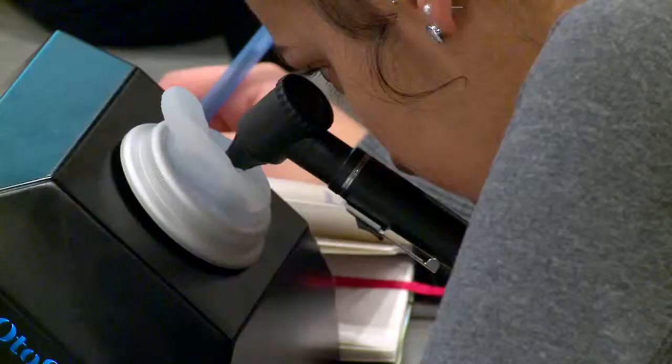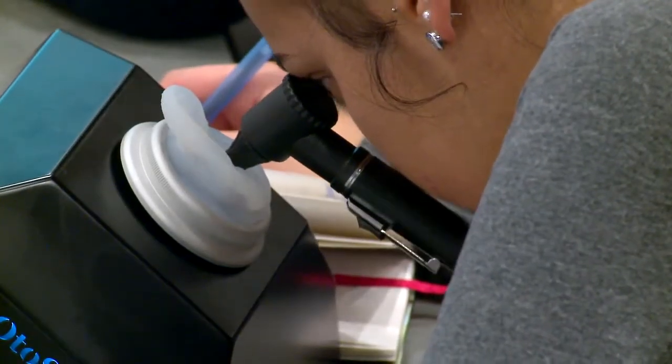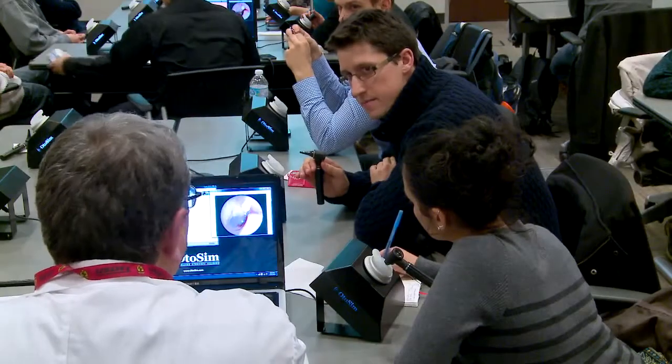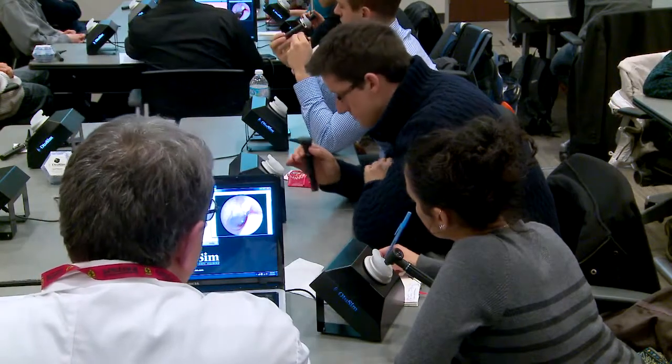On the floor, when we use it in the clinic, we usually will sit down with the 2 or 3 clerks and go through a majority of the common otologic diseases that they should know about. Because it's available on the floors, they can easily review that with their academy site director or faculty member, and you can have multiple students working on that.